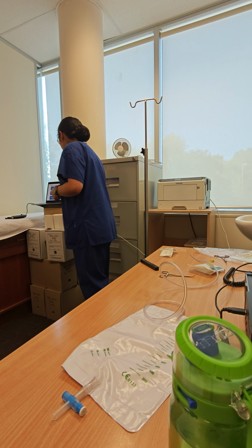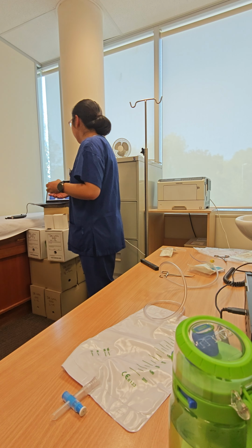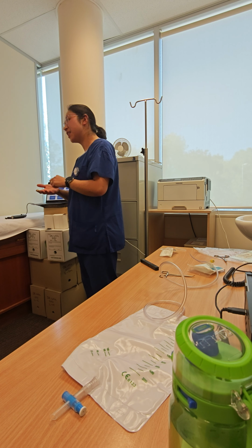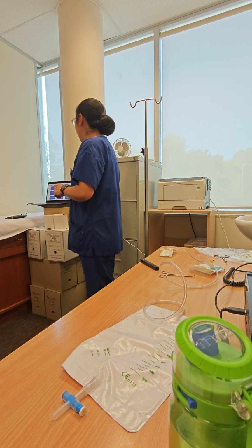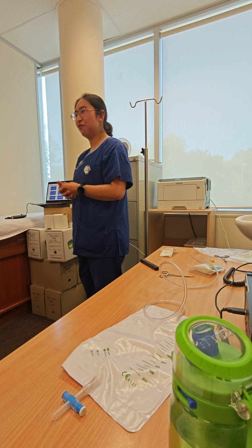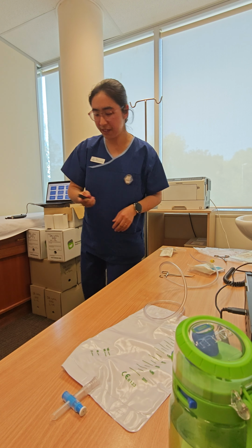So that's all. After that, we discharge the patient. We're going to start the post-processing of the images, and also make a record of the screening time and the screening dose of this cystogram. And then we're going to start to clean up the room, and that's all done. But don't forget to scan all the signed consent forms into your computer. That's all explained for the whole procedure.